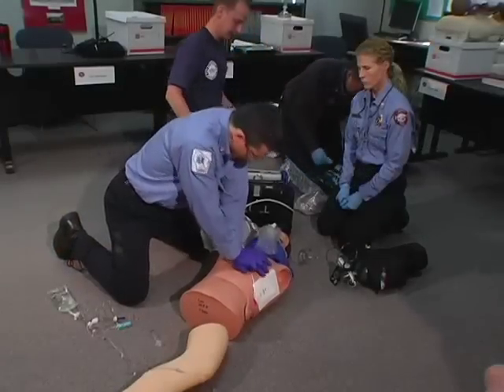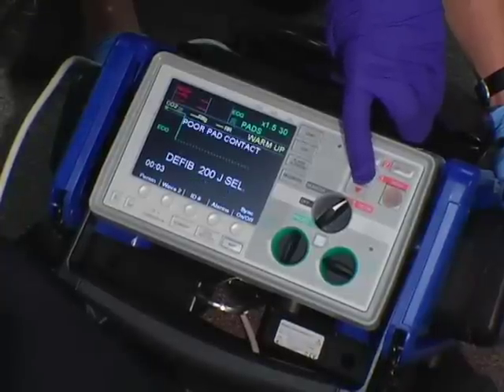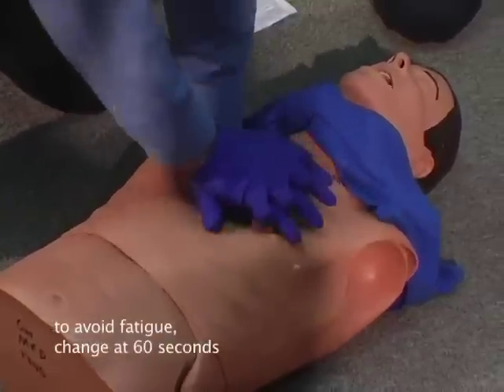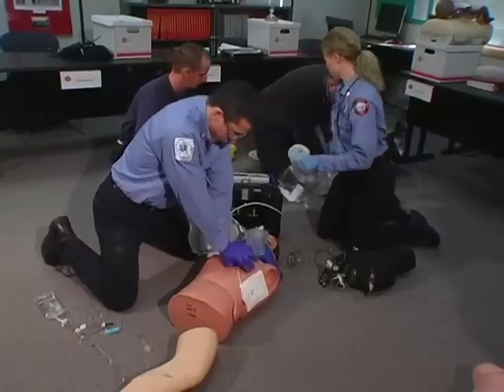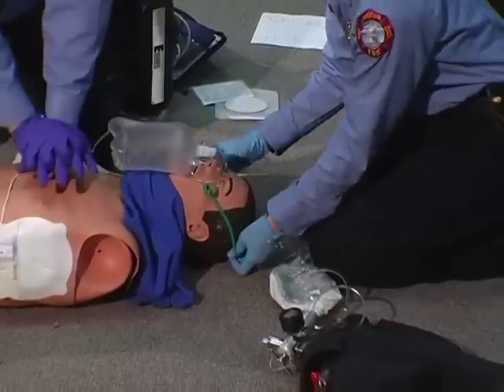Walking through the interventional sequence: monitors on. First intervention, make sure it's the 200 maximal joules dialed in. Immediate chest compressions, at least 2 inches of depth. Number three, metronome, to make sure our cadence is correct at 100 beats per minute. Fourth is airway and non-rebreather mask.